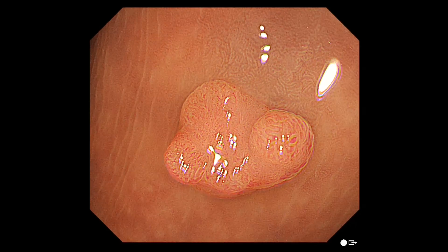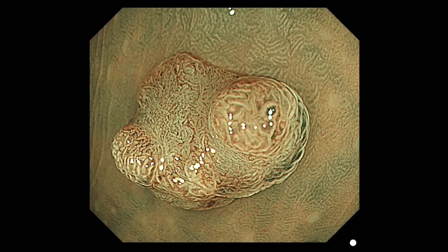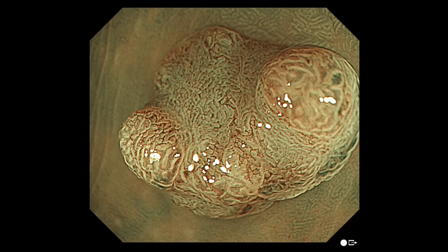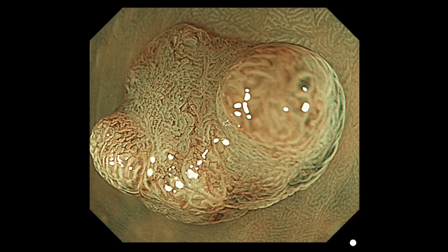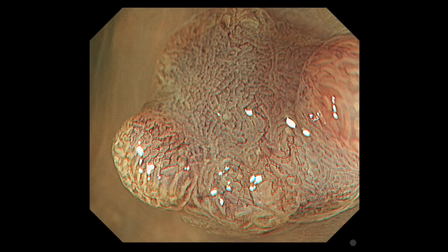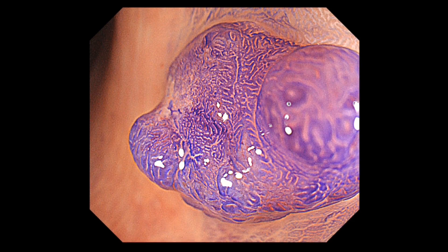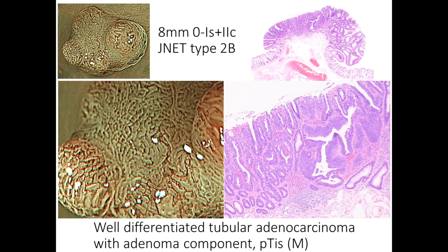Here we present a lesion 8 mm in diameter with a depressed area at the centre. While the elevated areas at the edge show regular vessel and surface patterns, the depressed area at the centre has variable calibre, irregular distribution of vessels, and irregular surface structure, so this polyp is classified as J-Net Type 2B. By staining with crystal violet, Type 5i pit patterns in the depressed area and Type 3L pit patterns in the elevated area are observable. This sessile lesion was removed by EMR, and the histopathological views show well-differentiated adenocarcinoma without any submucosal invasion.